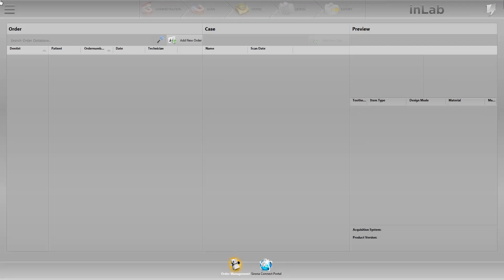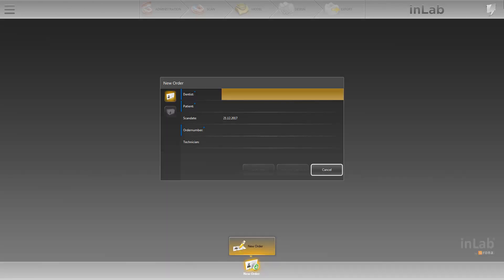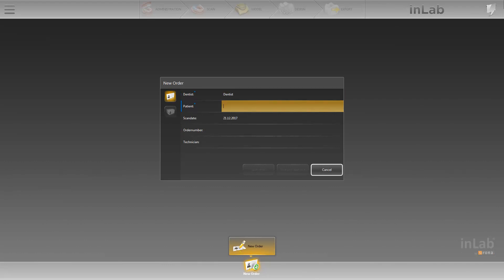First, we will create a new case. To do this, click on Add New Order. A new window opens and we enter the name of the dentist as well as the name of the patient. This information alone is enough to create the case — any further information is optional. We can now click on Save and Add Case.